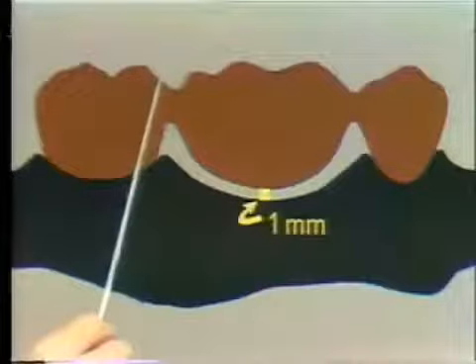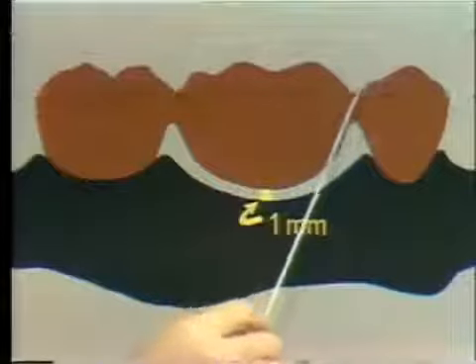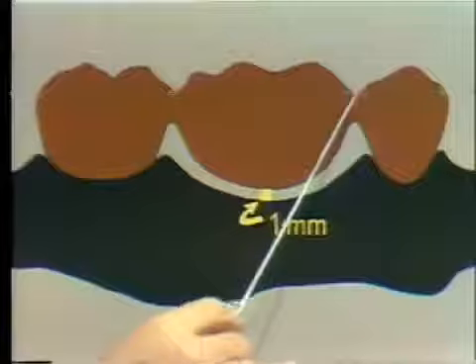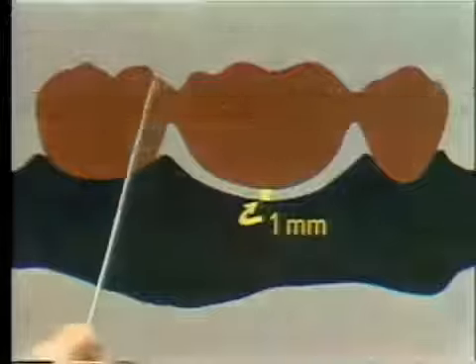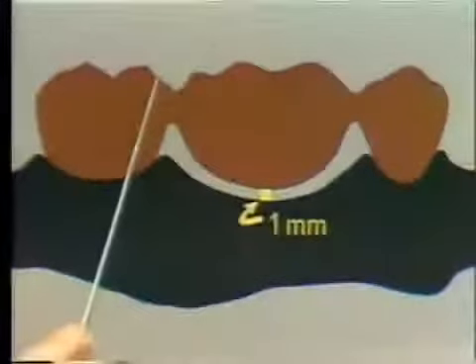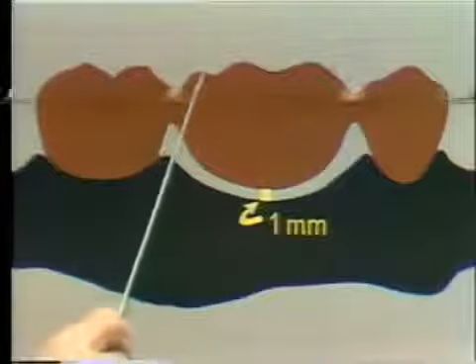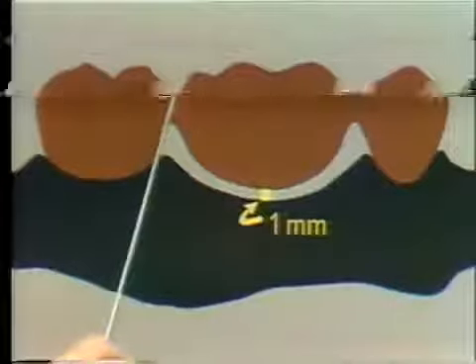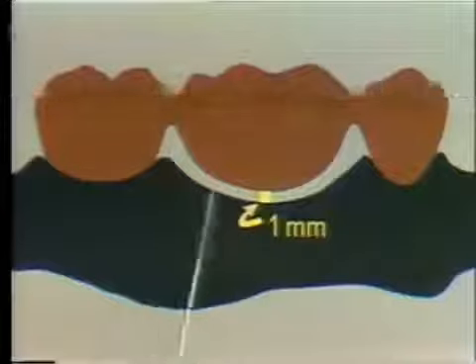the mesial here. It also shows another point which we've not yet covered, and that is developing an adequate occlusal embrasure in these surfaces here, where the distal marginal ridge of the bicuspid finishes, drops down, comes to the connector, and then rises again to a marginal ridge on the mesial of the molar. You see the same thing on the distal surface here. Marginal ridge of the molar behind, dropping down to the contact point, rising again in this area. The important things to develop in these Pontics are the occlusal embrasures here and here, the opened interproximal embrasure here, and the spacing from the alveolar tissue of 1 millimeter through there.